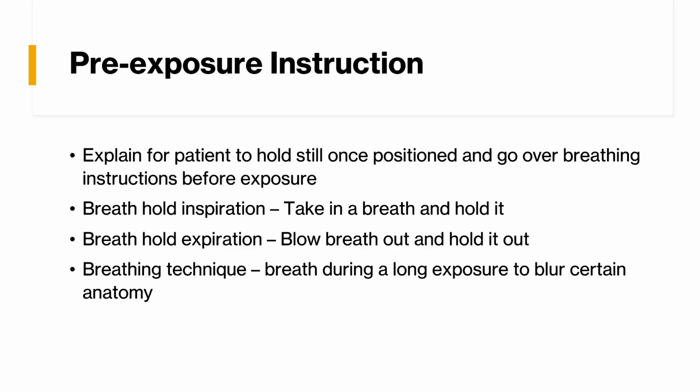Prior to exposure, sometimes you'll do breath instructions. So especially with chest imaging, you'll have them take in a breath and hold it. However, with inspirations and expirations, they almost never do a good breath the first time. So I usually say take a deep breath in, out, take a deep breath in again, hold that. With expiration, same thing but opposite.